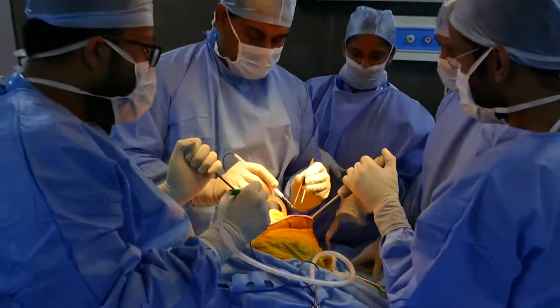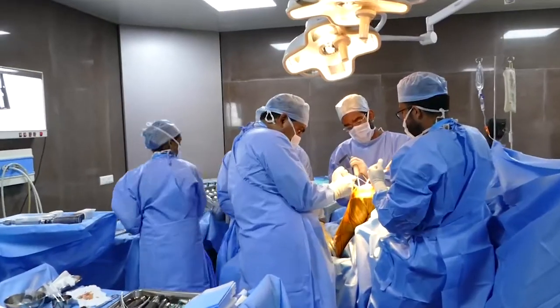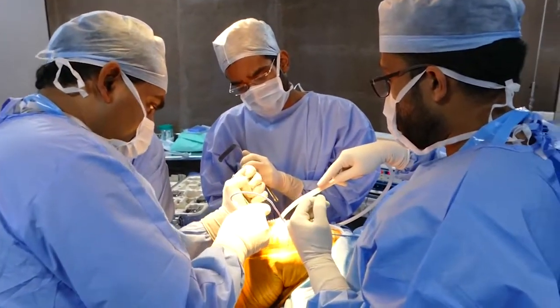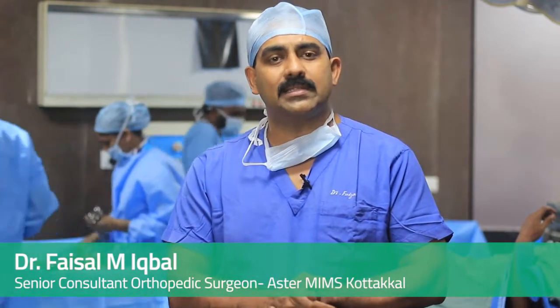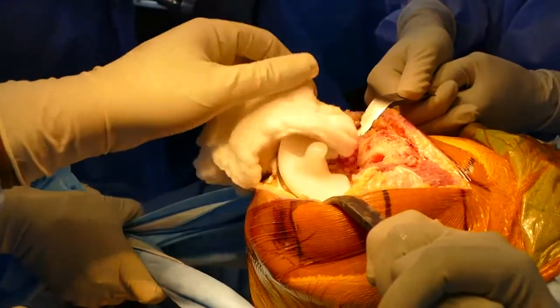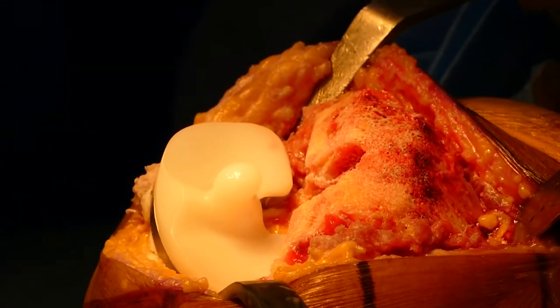Once the joint is ready for implantation, we again check all the alignments and correct the deformity, whether the joint is in a varus deformity, where it's bent inside, or it's bent outside. Whichever the deformity is, we correct it by the bone alignment cuts and soft tissue releases. Once everything is ready, the patient is informed that we are going to put in the implants, and the anesthetic team is ready, so that we use a special type of cement called PMMA, polymethyl methacrylate, to fix the implant to the bone.